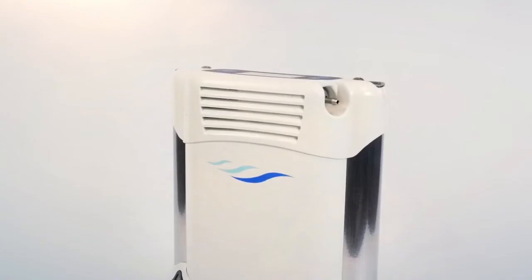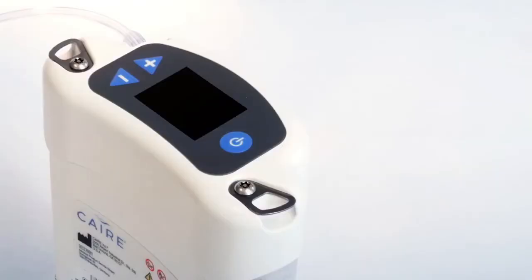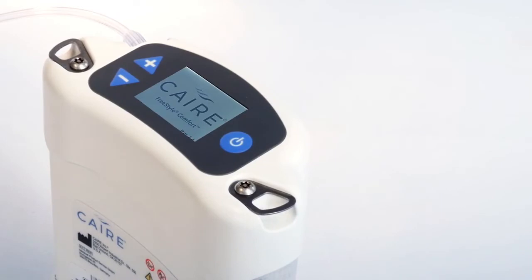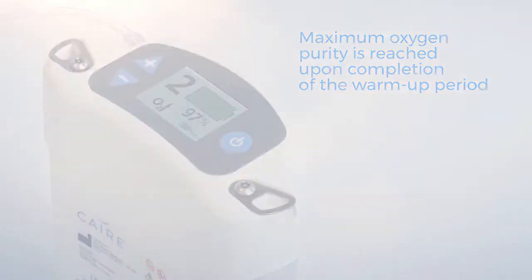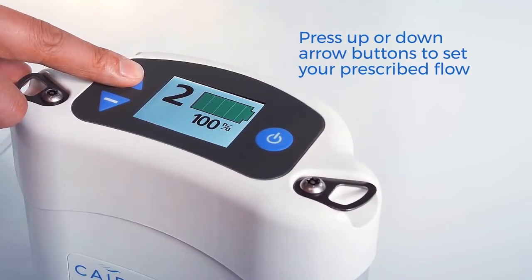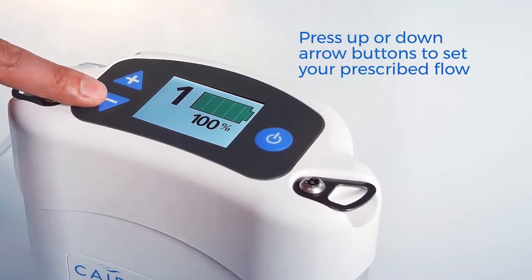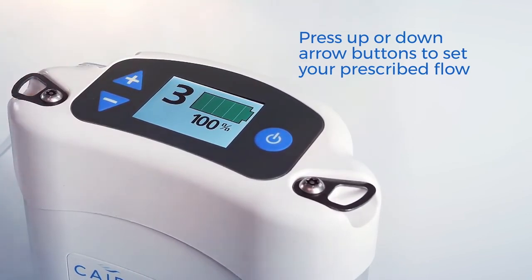After your battery is fully charged, the Freestyle Comfort is ready for use. Connect the nasal cannula into the oxygen outlet at the top of your Freestyle Comfort and secure it into place before positioning the nasal cannula on your face. Turn on the device by pressing the power button and remember to breathe normally. When turning on the Freestyle Comfort, the device will emit a brief audible alarm to alert you that it is operating. To select your pulse flow setting, press the increase button identified with the plus sign or the decrease button identified with a minus sign to set your desired flow rate. It is normal to hear a difference in sound as you change the flow settings. Your doctor will prescribe which setting is right for you. Once you have set your oxygen flow rate, you may feel a puff of oxygen delivered through the nasal cannula each time you inhale.